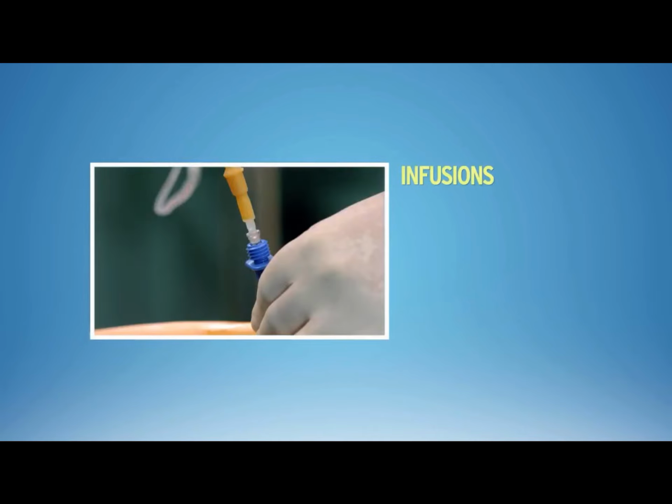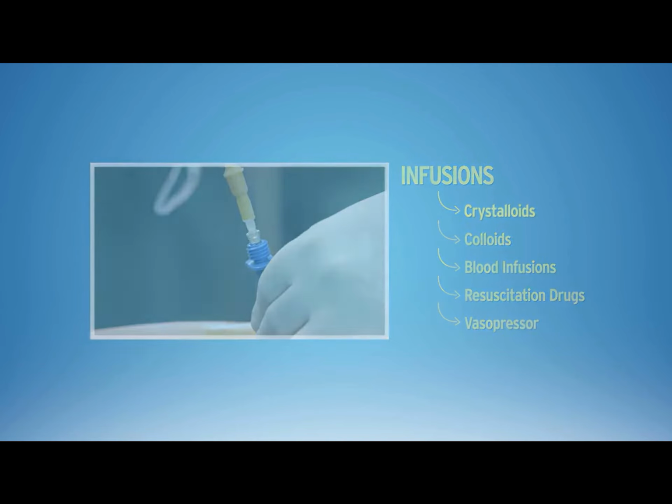Infusions. The following can be administered through the intraosseous route: crystalloids, colloids, blood infusions, resuscitation drugs, vasopressors. In addition, samples can be drawn from the intraosseous space in critically ill patients.